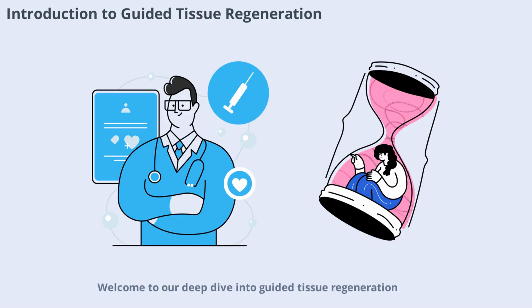Welcome to our deep dive into guided tissue regeneration, a transformative approach in periodontal therapy. This technique is designed to restore lost gum tissue and bone, offering hope for patients with gum recession or tissue defects. Over the next several scenes, we'll explore the indications, advantages, disadvantages, and step-by-step procedures involved in guided tissue regeneration.